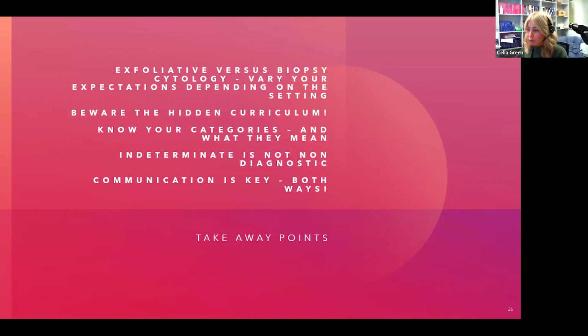Hopefully what machine learning will be able to do is remove the boring or laborious things that we do, like counting mitoses or finding things. Also, AI is really being developed as a second check. There's a lot of work, particularly in prostate biopsies, which shows that AI can run second checks and make sure we have a lower rate of error. So hopefully it'll be mostly reducing error rather than replacement.